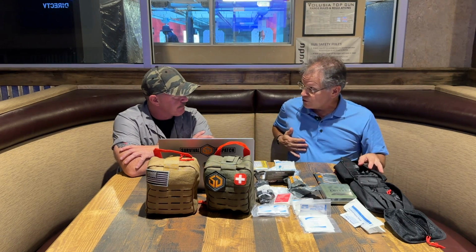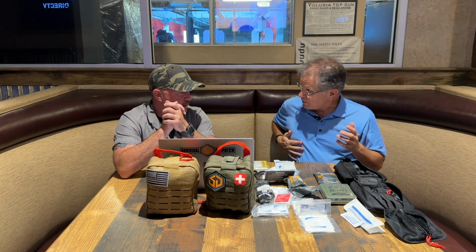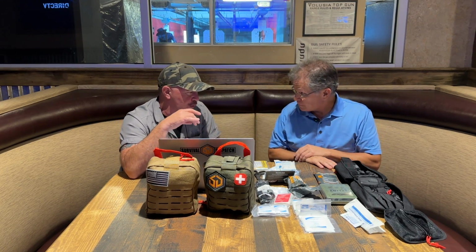If you don't get that sealed up, you will probably die. So it's important, especially if you're by yourself or you're miles away, you're going to need to put something on that to seal it. Same thing with a gunshot wound or something like that, or a bow and arrow wound.